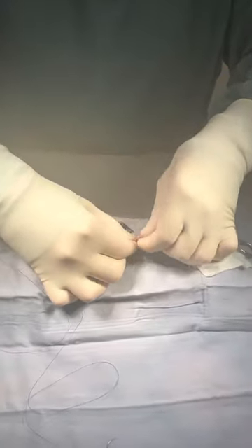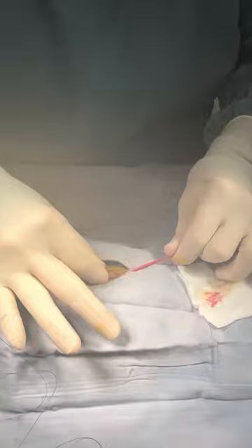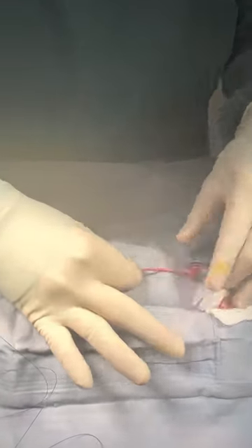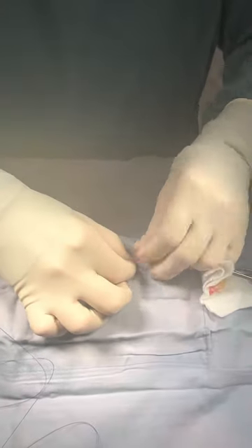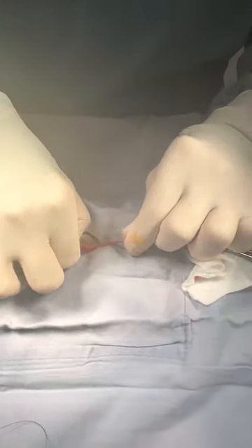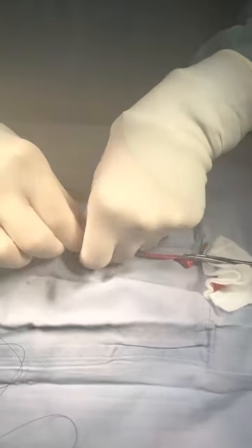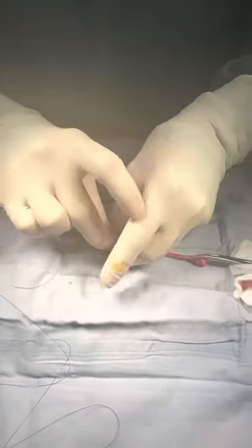Next we break down the broad ligament, which is very tiny in an immature cat like her. She is not in heat. This uterus is very tiny. The next thing we do is gain access to the right uterine horn by adding a little bit of tension and pulling up the horn until we get to the ovary on the right side of the body.